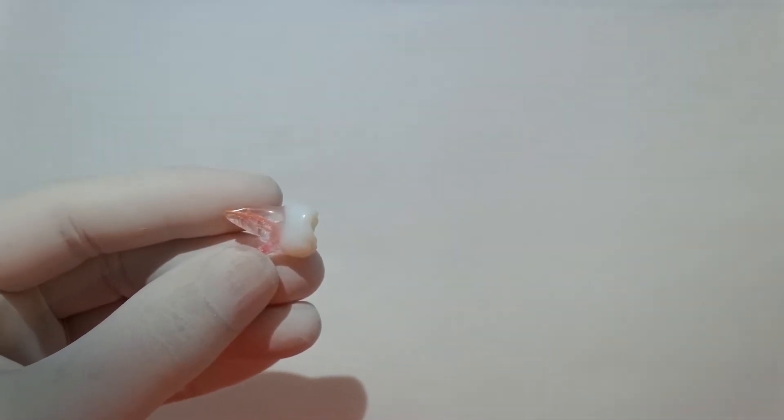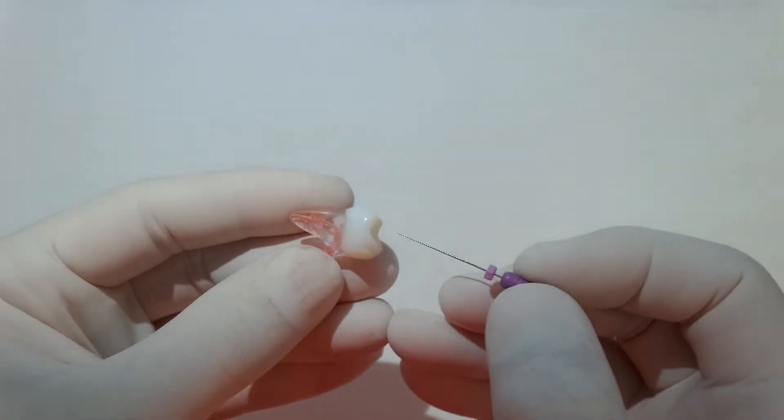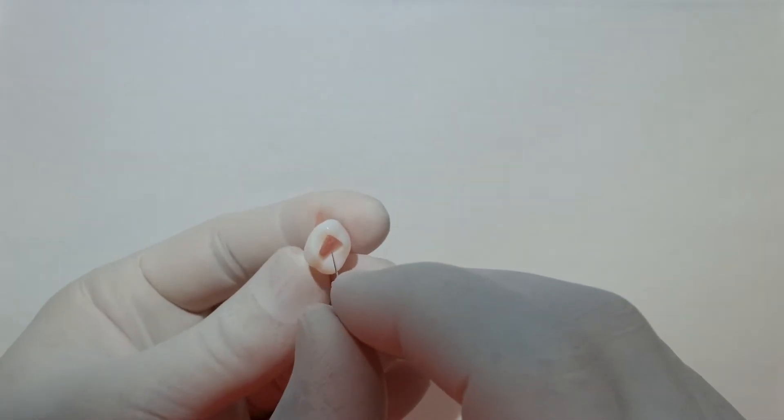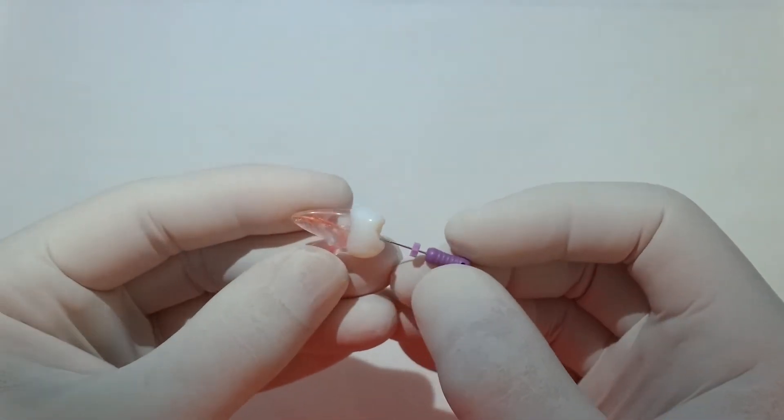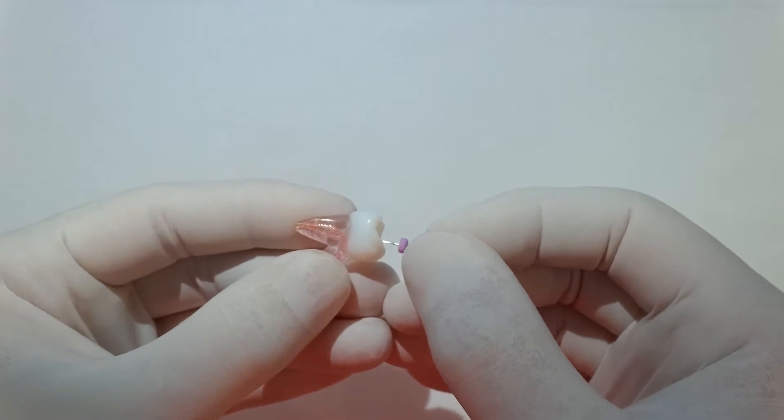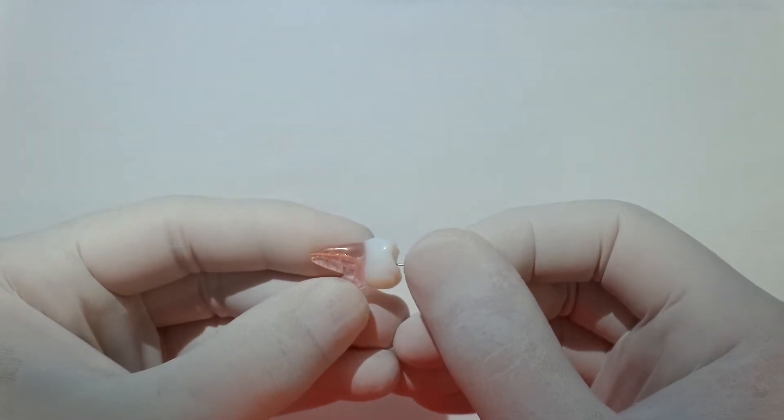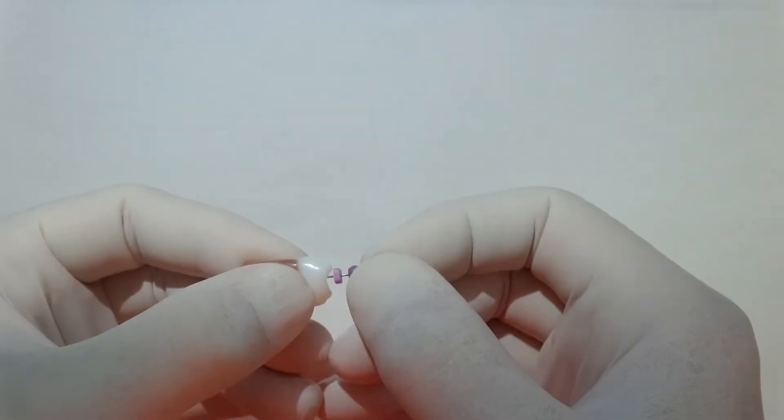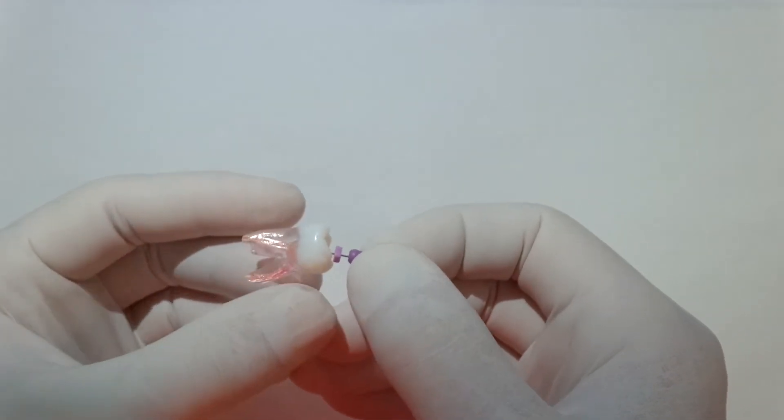There's an MB2 in there as well, just going to stick to the MB1. As we would in a patient, just going to initially negotiate it with a size 10 hand file. Rather than using x-rays and apex locators, we get our working length by putting the file right to the very end and seeing when it pokes out the end.